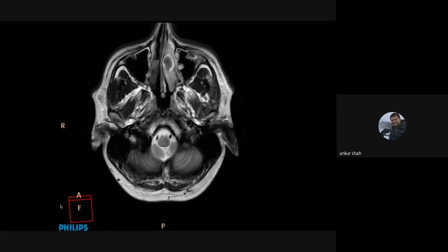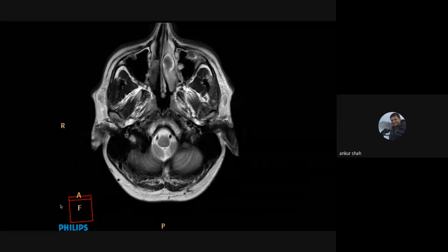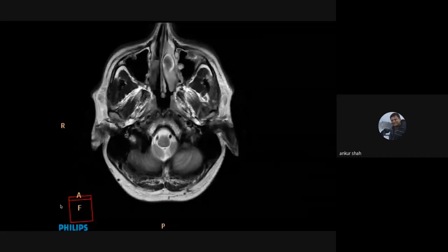Once you see maybe at least 200, 300 MRIs which are normal, then you will be able to understand that this is normal, because again, normal has so many subtle variations and you will always confuse it with some pathologies. But then maybe you see the report, or gradually you come to know that okay, this appearance is normal.